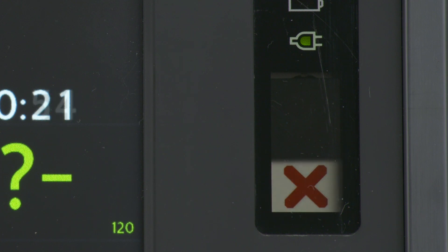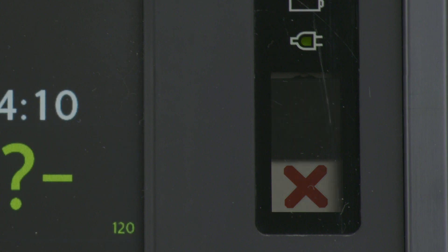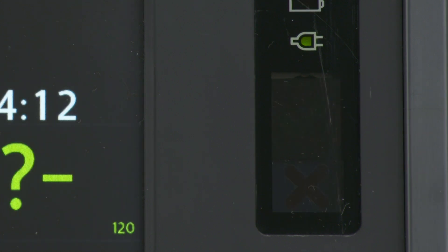A solid red X with a periodic audio chirp indicates a critical failure has been detected that may prevent the delivery of defibrillation therapy, pacing, or ECG acquisition. A solid red X without a periodic audio chirp indicates either there is no power available or the device cannot power on. After power is supplied, if the indicator reverts to the blinking green checkmark, the device is ready for use.